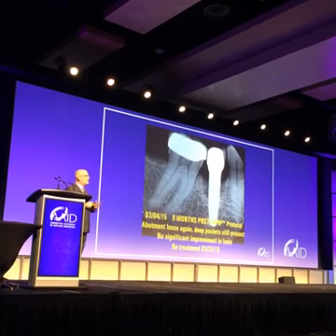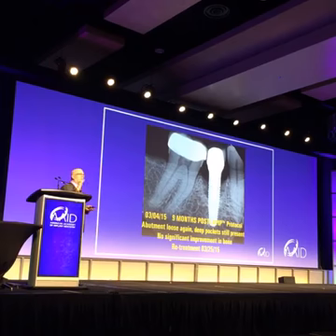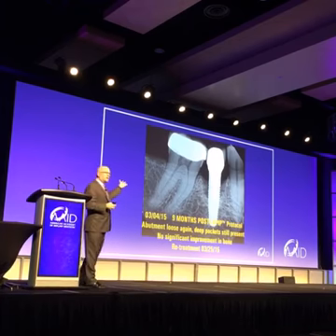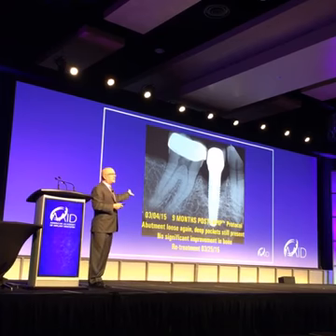9 months later, we still have the pockets, we still have the bone loss, and the reason was, everything's a learning experience, the implant abutment was still loose, and it was probably causing micro movement in the area. So I told the patient, look, I have to take this off. I have to bring it down to what we call the cover screw or healing abutment level, or we're going to retreat it. Now, if I had done this traditionally and I was still getting this, how much surgery is this patient going to allow me to do?